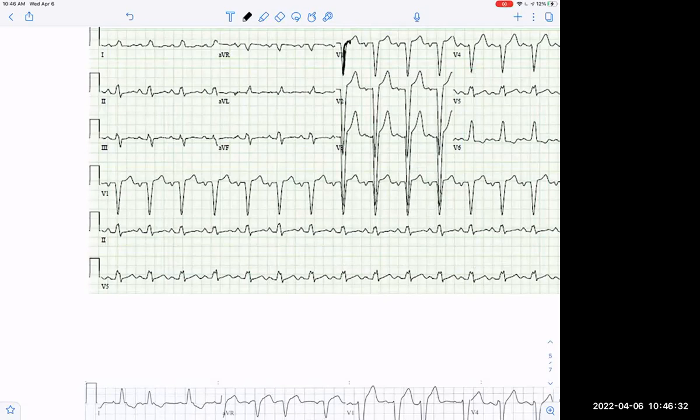All right, and we said we pull the turn signal down to turn which way? Left. Absolutely. So what type of bundle branch block is this? Left. Absolutely. It's a left bundle branch block. And we can confirm this by looking at criteria in other leads. I don't want to go into that quite yet, but we can confirm this by looking at some criteria in some other leads.